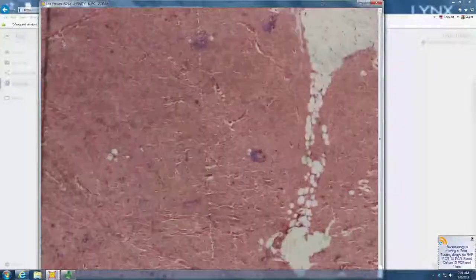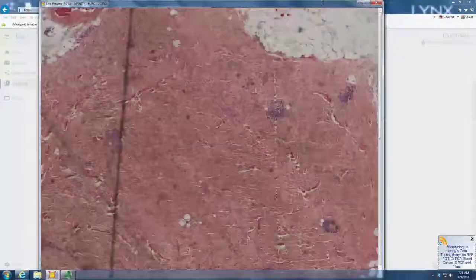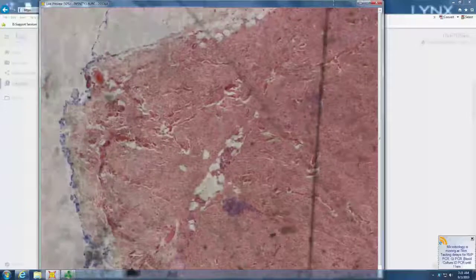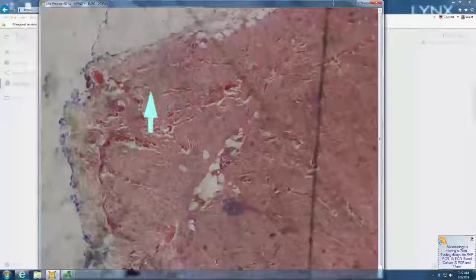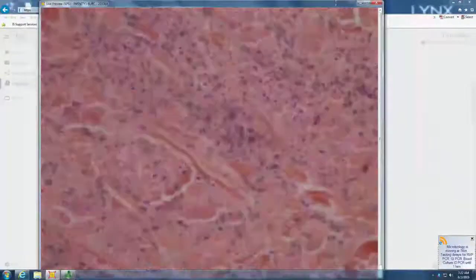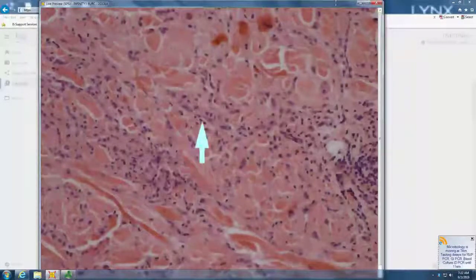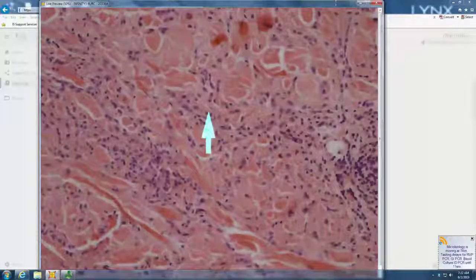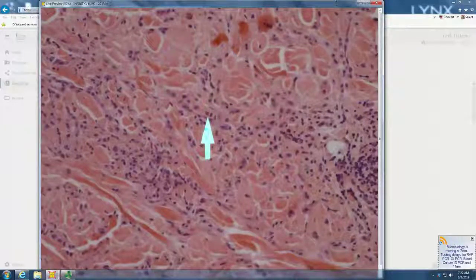Looks like we've got infiltrate in the dermis. Yep, infiltrate in the dermis. Kind of a busy dermis, kind of interstitial. At the periphery, some collagen balls. So it certainly suggests dermatofibroma. Let's look a little higher. Do the cells look like the cells of a dermatofibroma? Not really. Do you see them flattening off next to one another like little box cars?